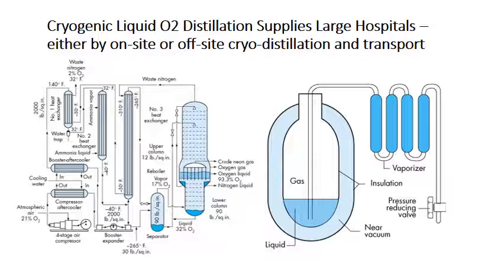The advantage of liquid oxygen is a much higher capacity, certainly, for oxygen, but also it is pure 100% oxygen. It has removed the minor contaminants that are present in an oxygen concentrator output, namely argon and trace gases.